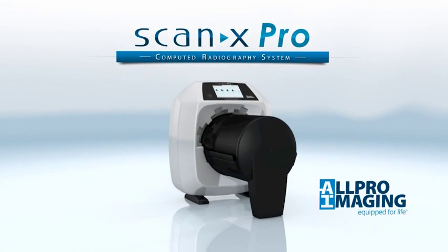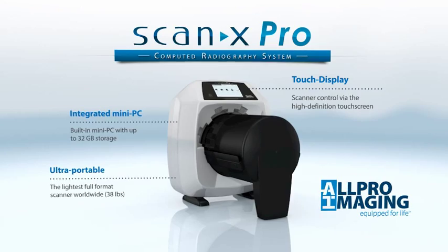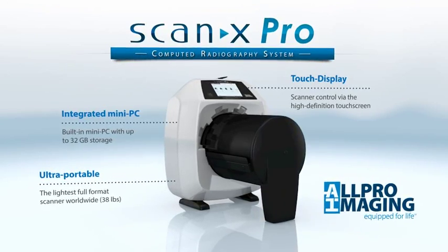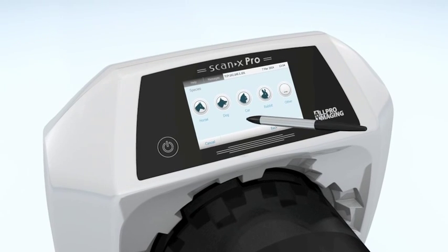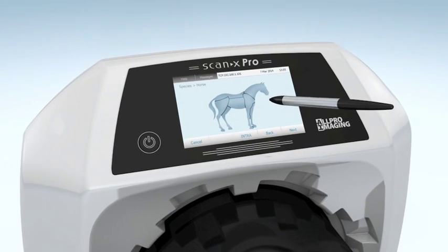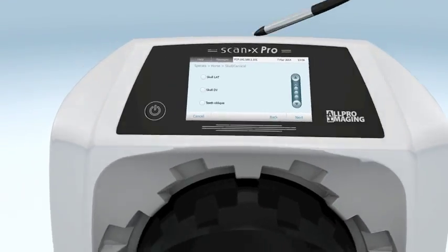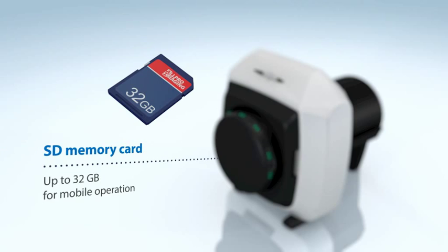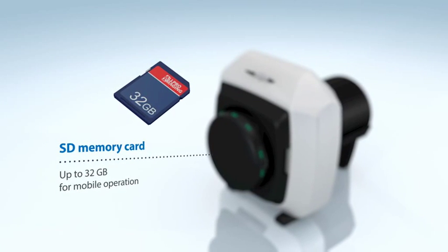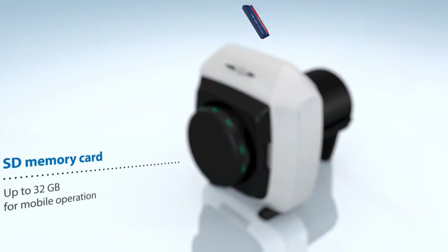The additional capabilities of the all-new ScanX Pro make this truly a unique device. With the exclusive integrated mini PC and large touchscreen, this unit can operate in standalone mode whereby images can be acquired and previewed without a PC or laptop. The scanner has an SD memory slot, up to 32 gigabytes, for storage of image data if operating in standalone mode or outside of the office.